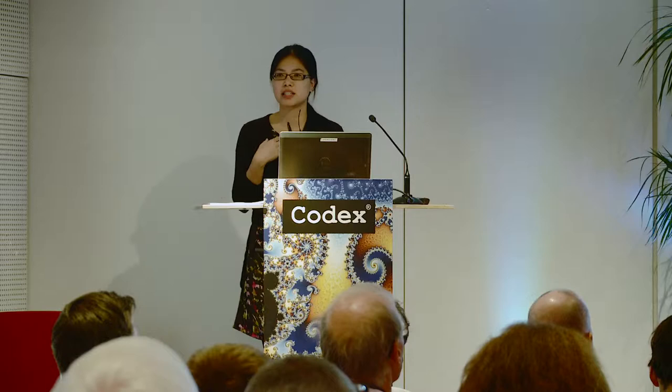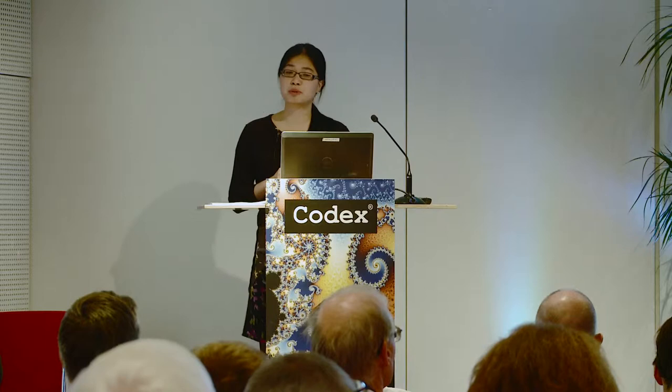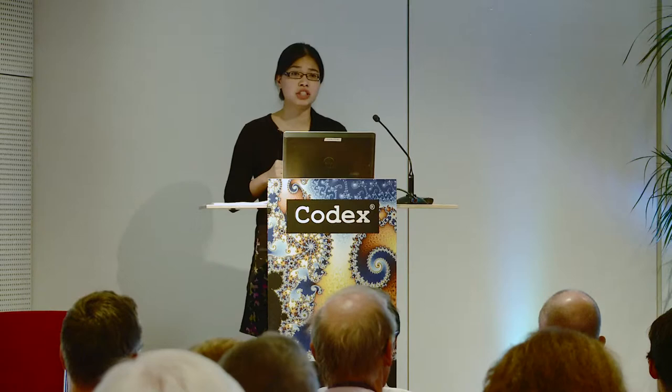I'd have to say thank you to Lord Darzi for introducing this very briefly. So in terms of endovascular, if you're not familiar with the procedure itself, these are minimally invasive procedures whereby you're introducing very, very thin guide wires and catheters, not dissimilar to this kind of cable here, through your femoral or iliac artery, and then it's fed all the way up your aorta. Depending on where you need to go, you may need to have a stent graft implanted. It may need to go all the way to the heart for electrophysiology procedures.